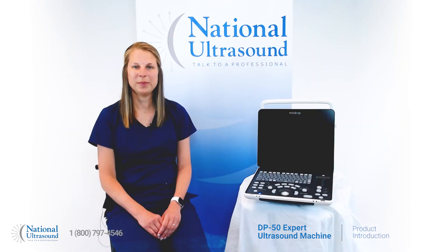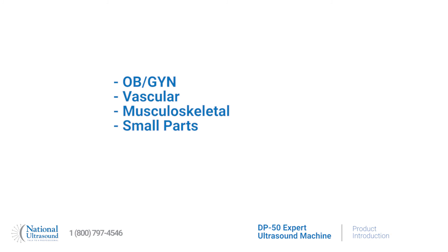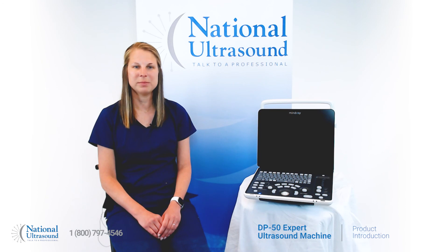Overall, the Mindray DP50 expert ultrasound system is a great solution for the practice looking to perform consistent OBGYN, vascular, musculoskeletal, small parts, and general imaging exams. Schedule an online demo today with your national ultrasound sales rep.